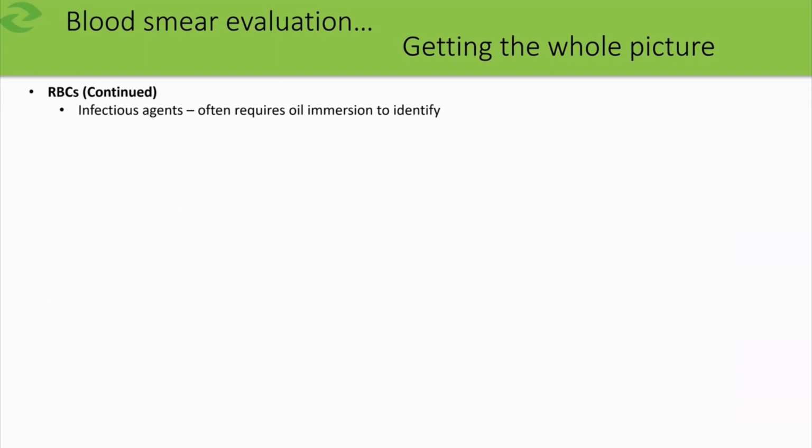All right, so let's move away from shape changes and into infectious agents. Really, it requires at least 50x and either some form of digital zoom, or if conventional microscope, 100x oil to even see them, number one, and then to try to further identify them.